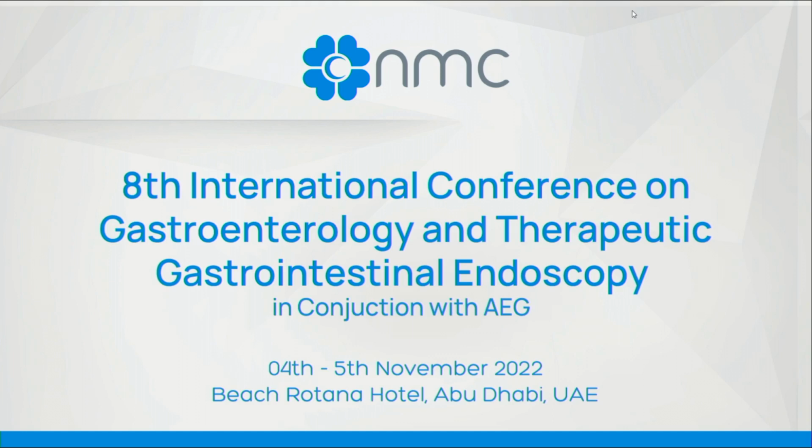procedure. And in the liver, we don't usually perform EUS for lesions which are supposed to be metastatic, because then the disease has already spread. So even if there is a track, the patient already had metastatic disease, but it will change the management for that patient, because if you are planning for a curative resection and you prove that there is a liver metastasis or a spread anywhere else, then the entire spectrum changes from curative to palliative settings.